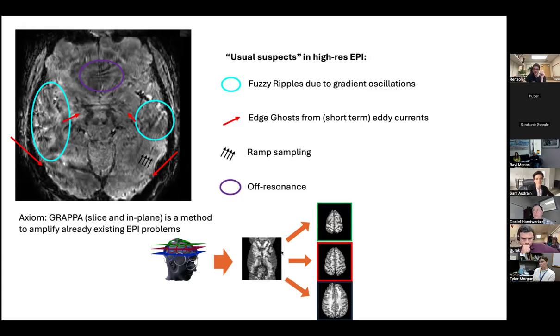However, now imagine there's additional aliasing in there, for example, conventional 1/2 Nyquist ghosts. Then we have this unknown aliasing pattern, which is then basically amplified when GRAPPA tries to unalias the image based on the coil sensitivities. So that tells me the approach to fight those artifacts is to reduce the aliasing pattern in the base image as much as we can, so then GRAPPA can work more effectively.